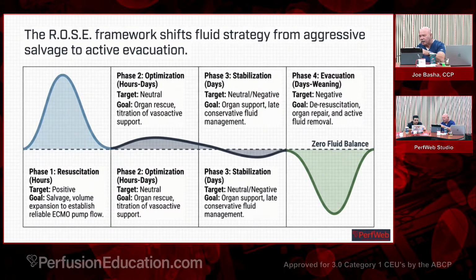So this is where you're basically going from day one. Phase 1, phase 2, phase 3 is all about just getting this patient stable. And then at that point in time, you're already starting to deresuscitate the volume, but now you really want to start getting volume out. Right. And these phases are not per day, they're just phases of the process. Correct.